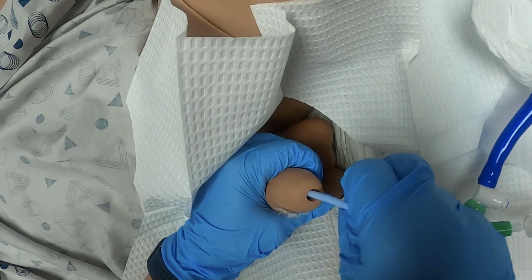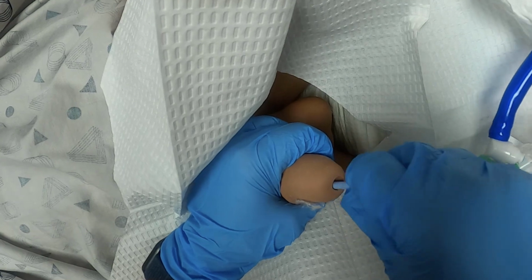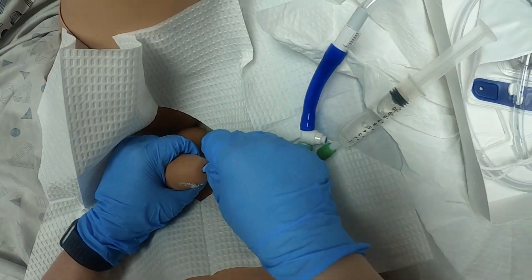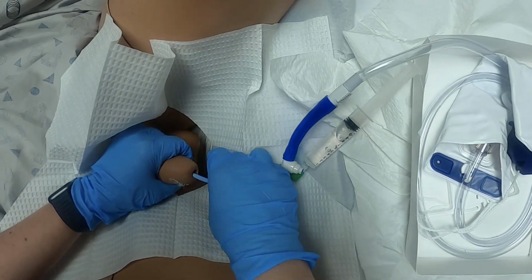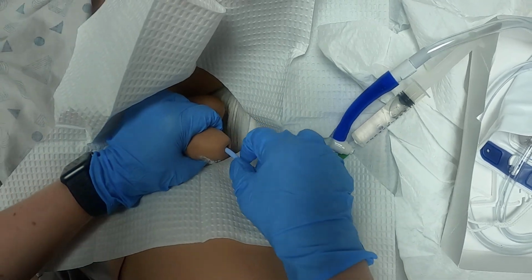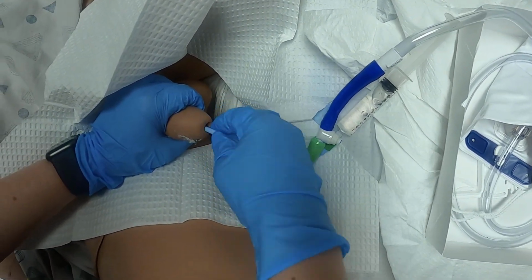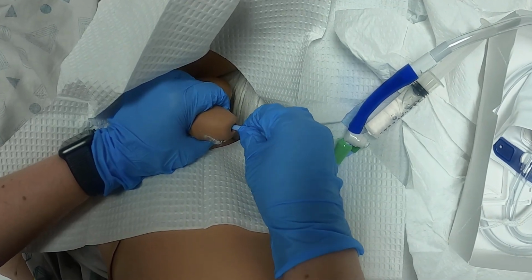Take a nice deep breath in. Okay, you're gonna feel a little bit of pressure. I'm gonna insert, insert, insert. You're going to start seeing some urine coming out, okay, in your tubing. Since this is a mannequin, you're not gonna see this, unfortunately. However, in a real person, you do see that, okay? So once you see urine flashback right here in the tubing, you do advance it another inch and a half, okay? So you're at this point here.